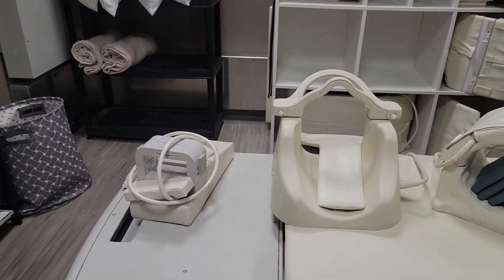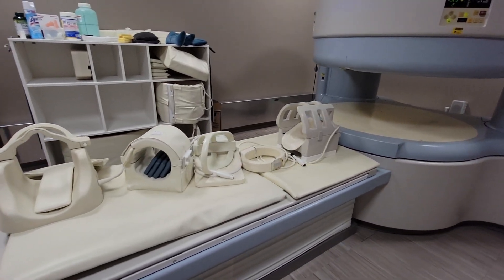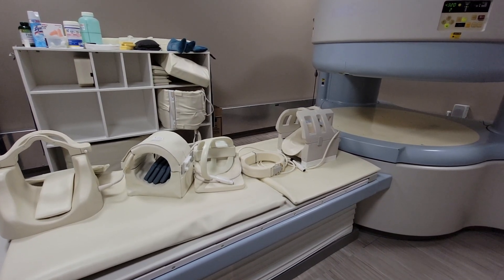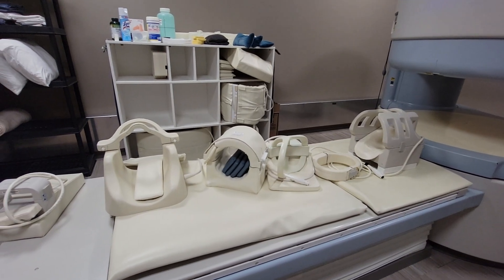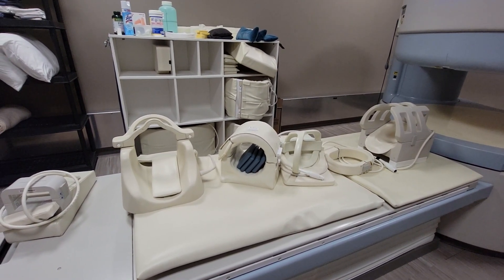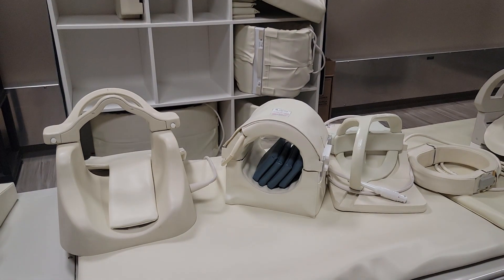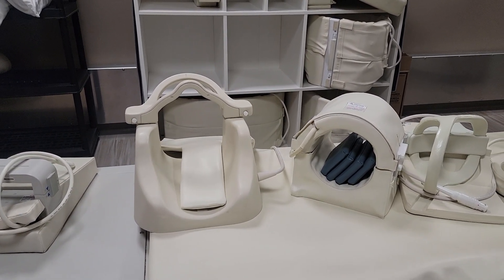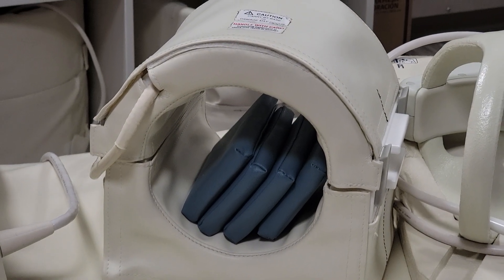Now you can scan anything you want basically. Sometimes I use the head coil to scan ankles and feet, and you can pretty much scan anything as long as the part fits and you get good signal. Sometimes I have to use the c-spine coil to scan larger knees if they don't fit on the regular knee coil.